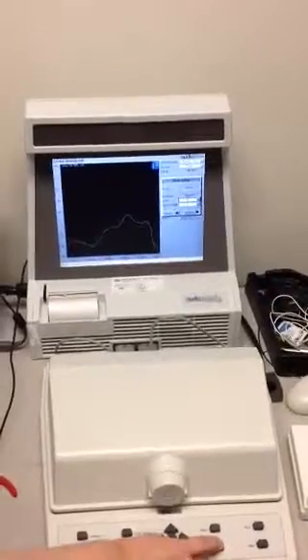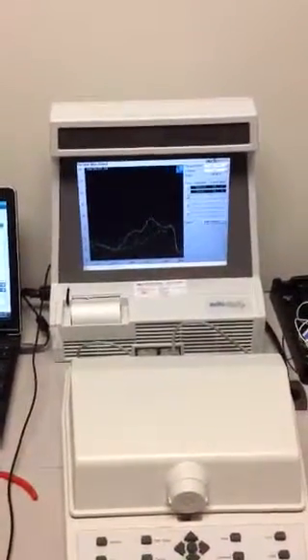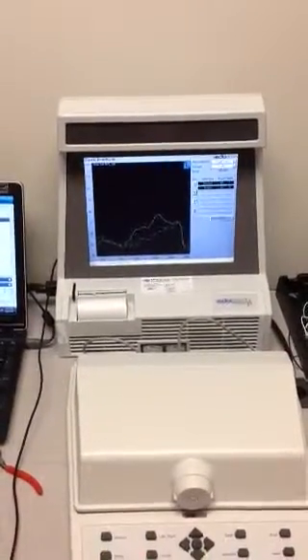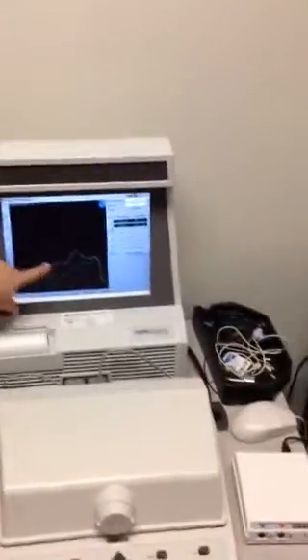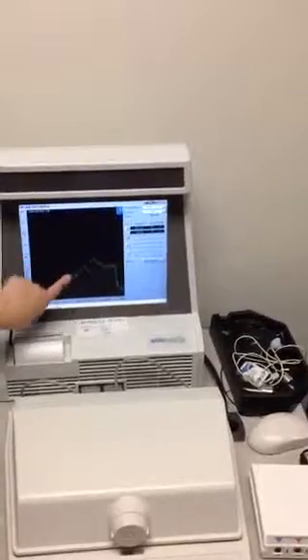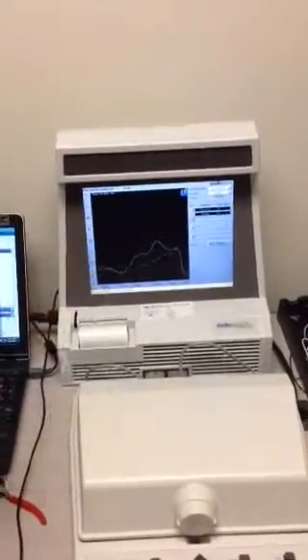And then just like in a test box, she says, I think, 7 seconds of about 13 different languages. So she's never saying a full sentence, she just says different things. But you're looking at the same separation you see in a test box. You want the front speaker, which will be labeled as F, and B for the back speaker to see the same separation you would in a test box.